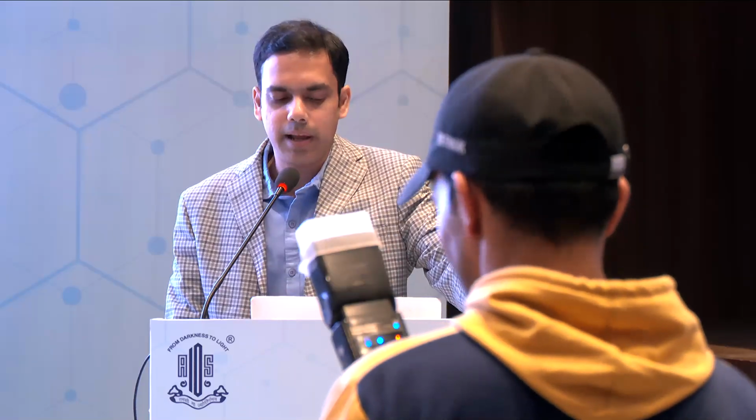So there are various imaging modalities. Plain X-ray is a good screening tool. CT scan has high sensitivity and can detect multiple IOFBs. MRI has better visualization, but is avoided in magnetic IOFBs. USG helps in surgical planning especially. UBM and ASOCT are especially for anterior segment or sulcus foreign bodies.